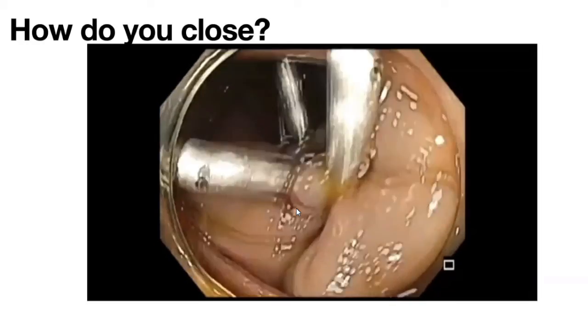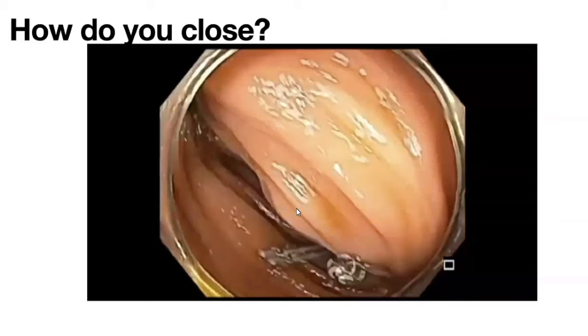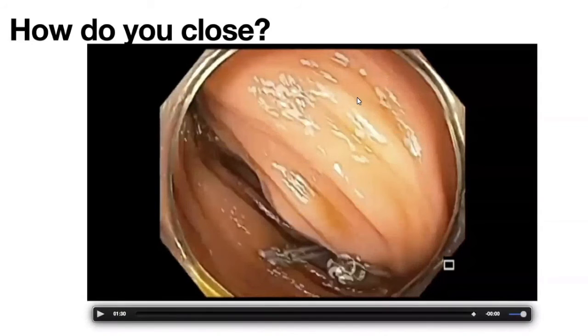So after the resection and closure, you also want to make sure that you have a nice approximation. And so we restarted his blood thinner 24 hours later, and he has done well without any adverse events. And the pathology came back as, as Noria suspected, sessile serrated adenoma. Margins were clear. So that's the news.